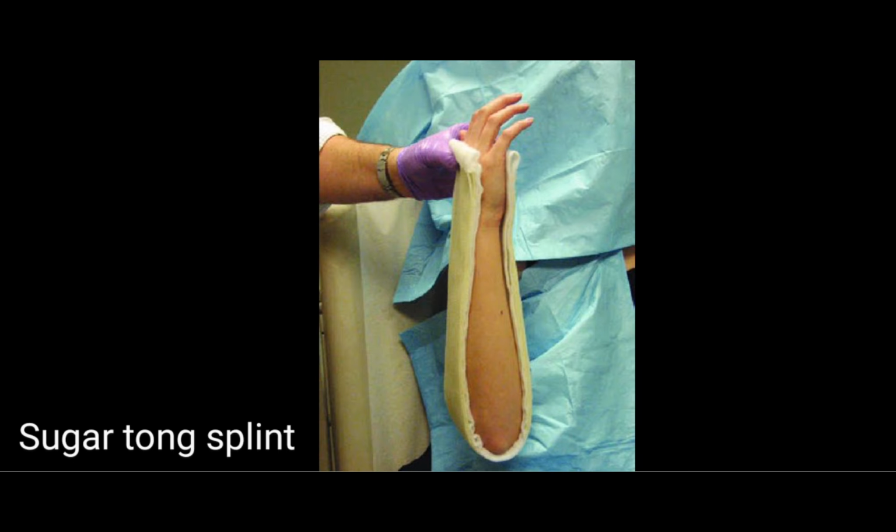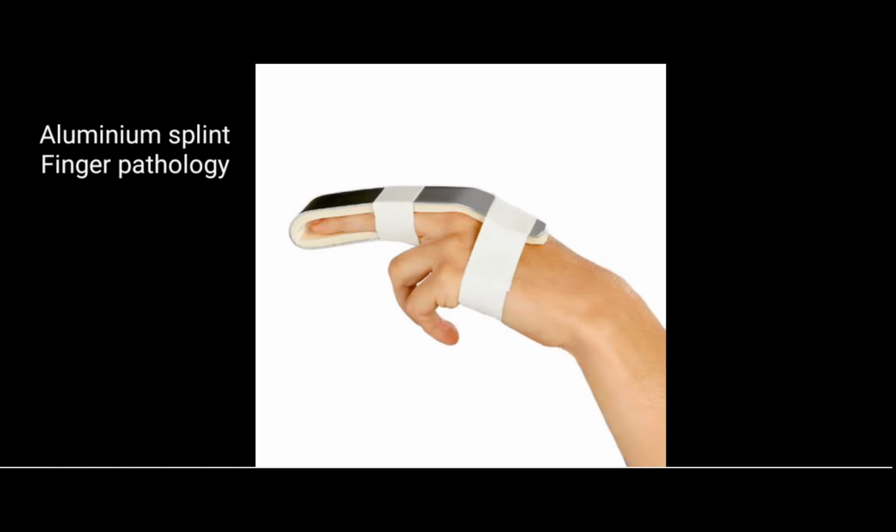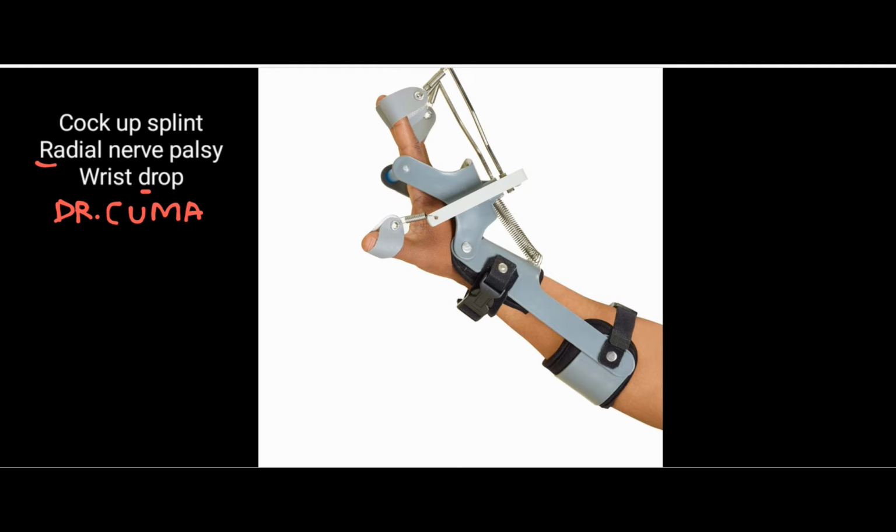We'll be revising again, and one splint not mentioned here in the images that I need you to remember is the dynamic finger splint. Dynamic finger splint will be like the cock-up splint, but here we can move the fingers, meaning we can flex the fingers. This splint holds the fingers in extension, but the person can flex the fingers in between to prevent immobilization.